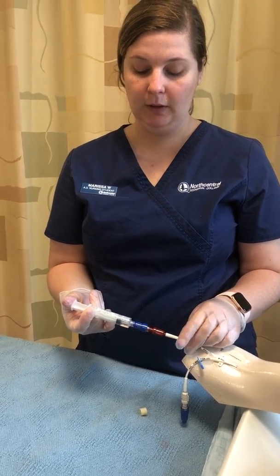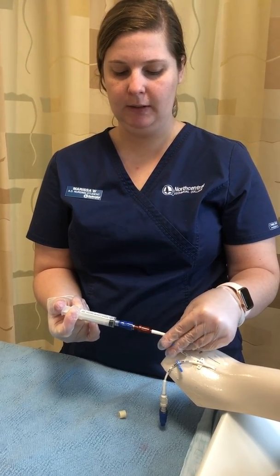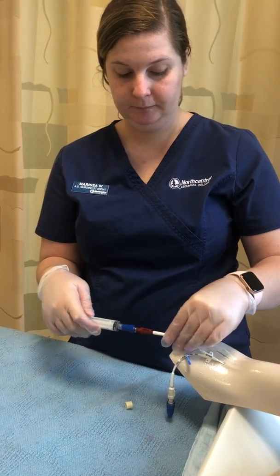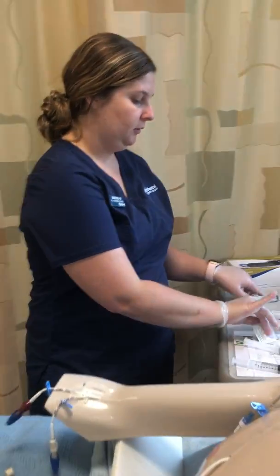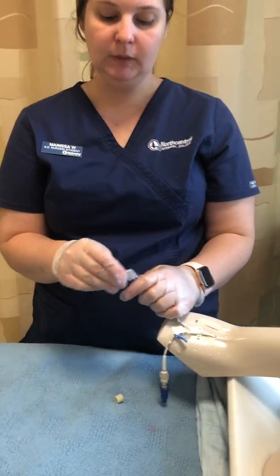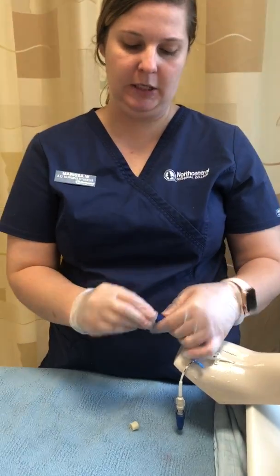I check my mark. Alright, and then once my flush is done here, I'm going to go ahead and reclamp my PICC here. I would check for allergies. Alright, and then I can disconnect this. And then I'm going to grab another alcohol wipe. So now the next one I'm going to be doing is the one that has my lorazepam medication in it.